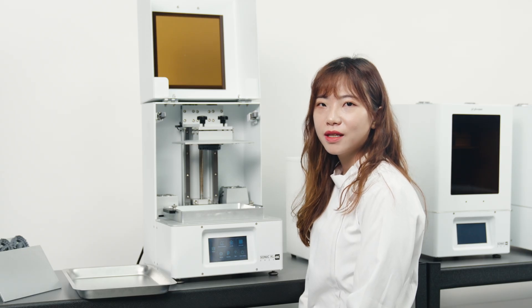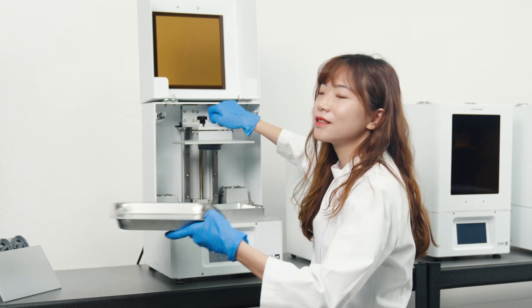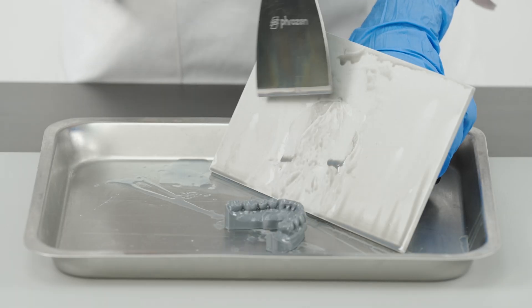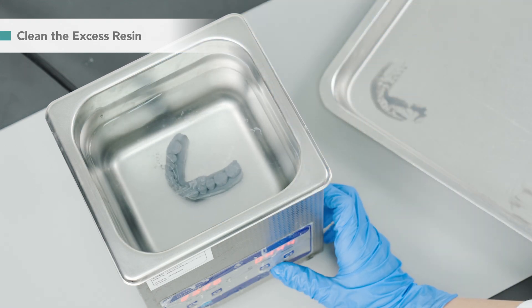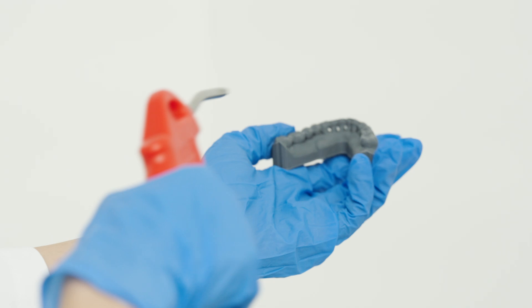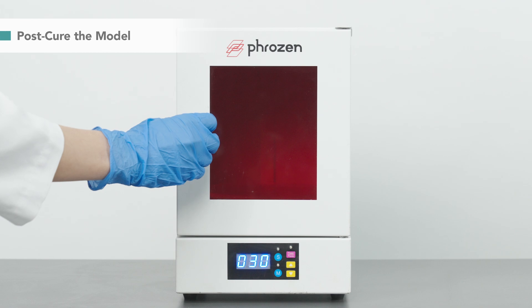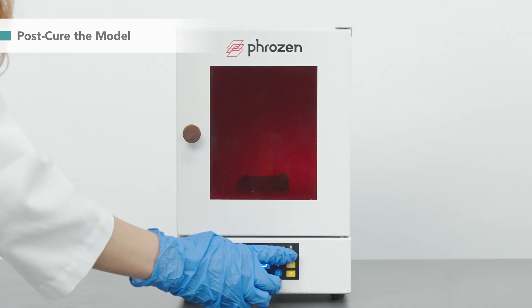After 55 minutes, the print is complete. Let's remove it from the building plate. Clean the excess resin with IPA or 95% alcohol. Use a compressed air gun or simply keep it in the dark for 30 minutes to dry the model. To increase model strength and stability, we post-cure it with a UV cure station for 30 minutes.